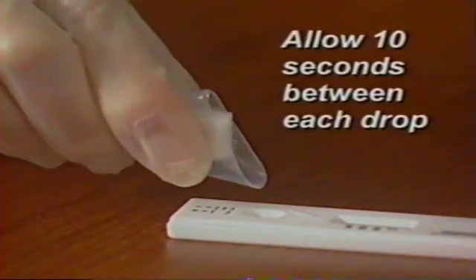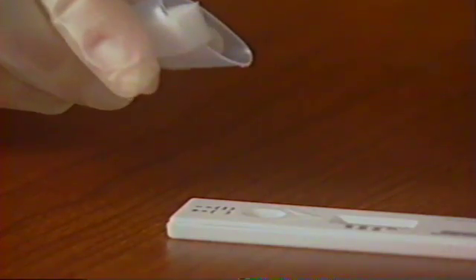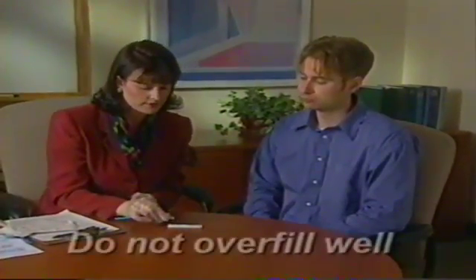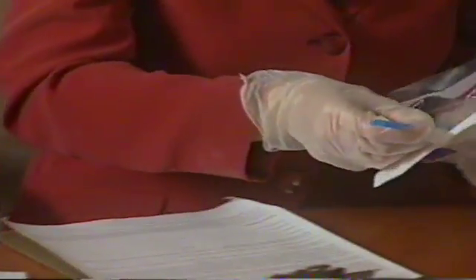Carefully place 4 drops of oral fluid, one at a time, into the test device sample well. Allow 10 seconds between each drop. Do not allow the collector to touch the bottom of the sample well or the test strip. Note, it is very important not to overfill the well, as this may affect the performance of the test. Properly dispose of the collector after the 4 drops have been placed in the sample well.